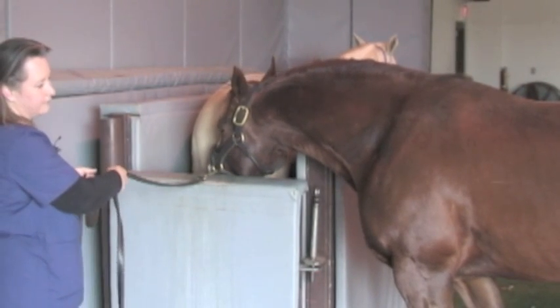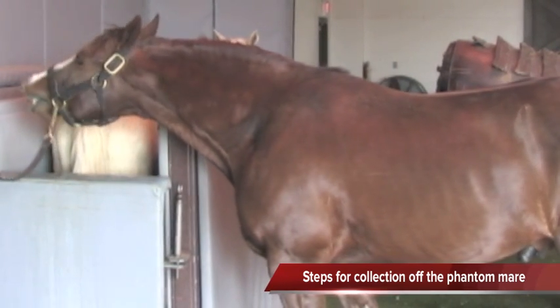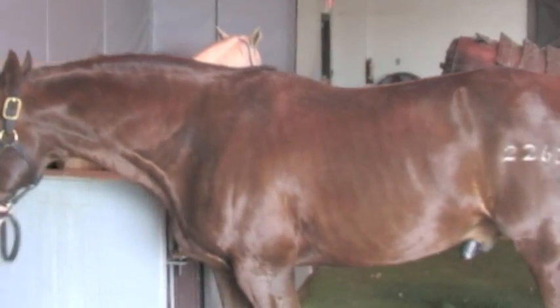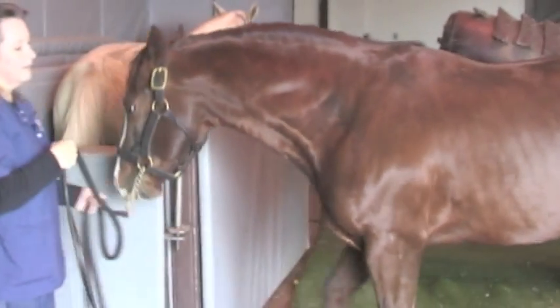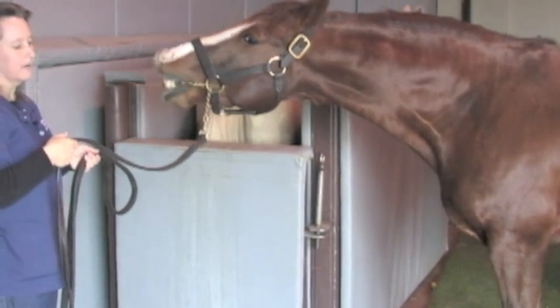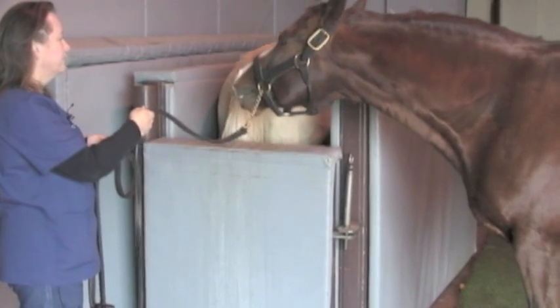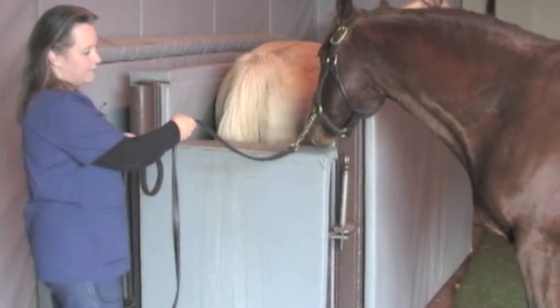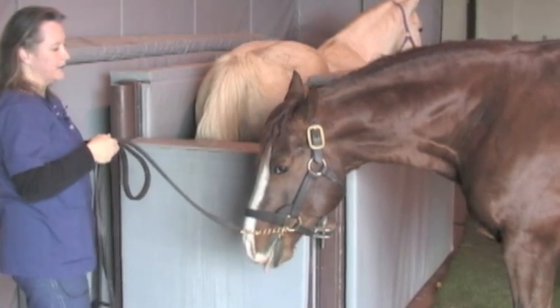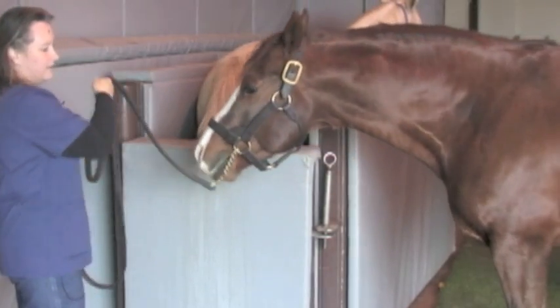Our sequence of things would be that the stallion would tease up and then we would wash his penis to get rid of any smegma that may be present. Then we would collect him off the phantom, which is behind him right now. The phantom is used to help protect the stallion from injury from a mare kicking him. It also protects the mares from stallions that are very vigorous in their breeding. We also have the ability to wrap it with saran wrap, which protects the stallion from passing diseases from one to the other.